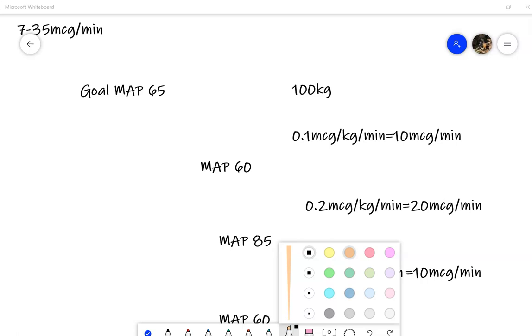Inevitably, in training, and we've seen this in both the clinical or simulation scenario and in real-life scenarios, there's a natural tendency to want to titrate the epinephrine drip differently than it should be. So let's go back first and say, what is our goal?